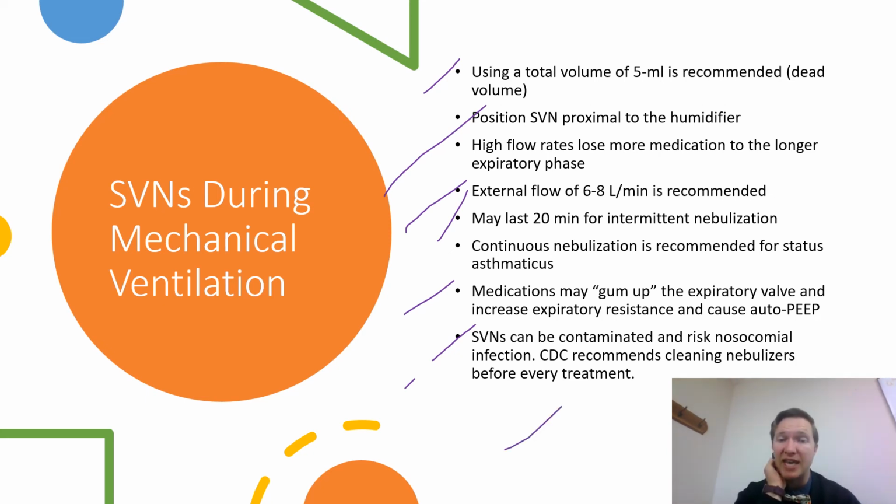Then look at the last one here. Small volume nebs can be contaminated and risk giving a patient infection. What happens to that nebulizer when we take it out of line, right? The neb acorn. What do we do with it? Do we rinse it and put it on the counter to air dry? What do we do with it? Do we rinse it appropriately? Do people touch it with their contaminated hands while we have it air drying, right? So it's a potential source of infection when we take it out and put it back in. It's almost as if it's a circuit break, right? So it's a risk for nosocomial infection.